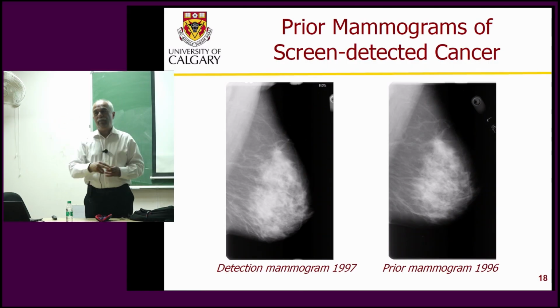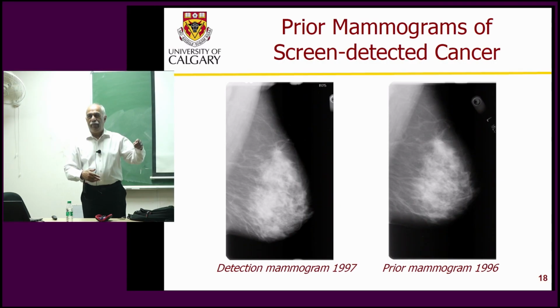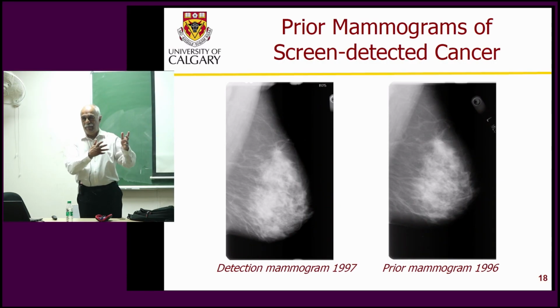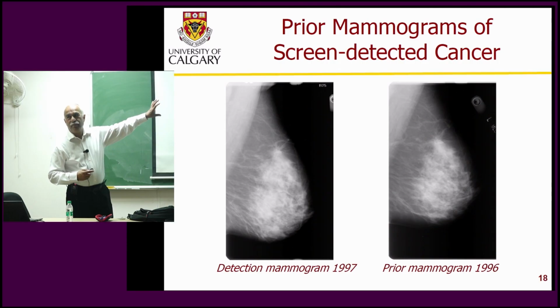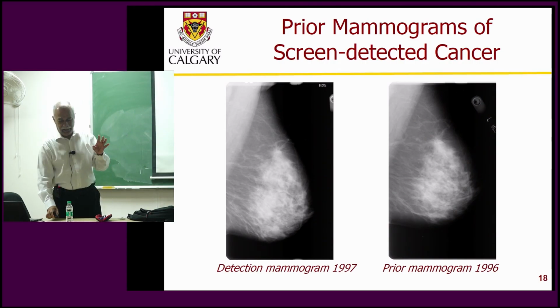That information comes to the cancer board and to the screening program, and the radiologist will review the previous mammograms to see what was happening before the cancer was detected. So we got such films. As I said, the screening program is extremely tightly controlled for good reason.